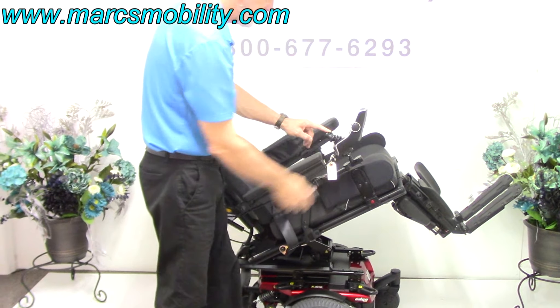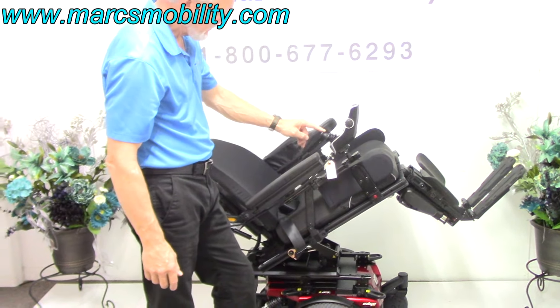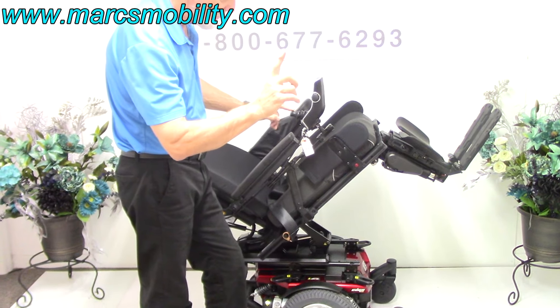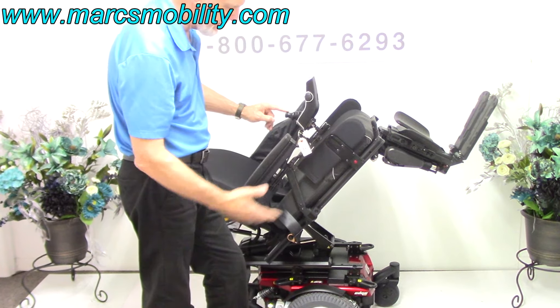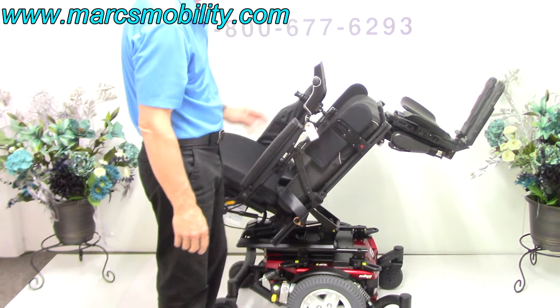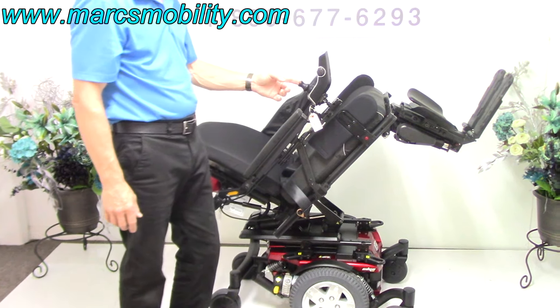This chair has about one mile on it — it's brand new, probably never used. That's the electric tilt. If you want to do the legs while you're up, you can — these are good for circulation.